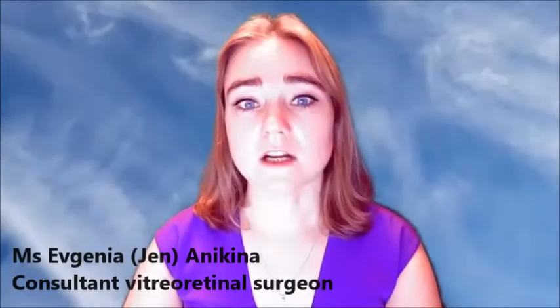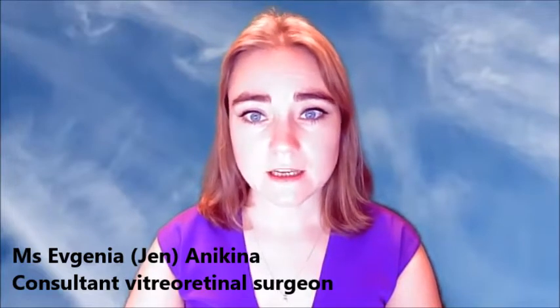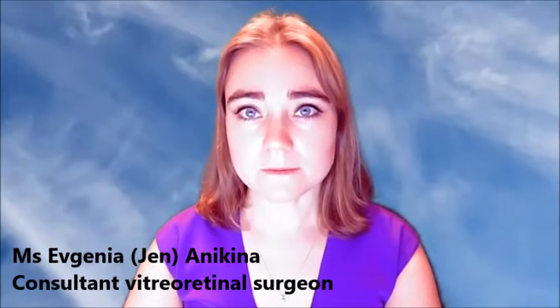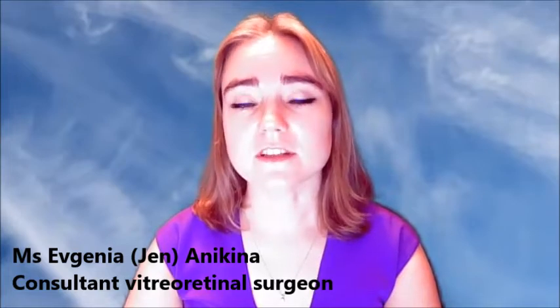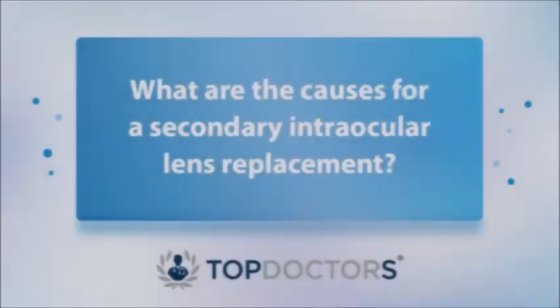If you have suffered a complication during cataract surgery and you have needed a period of healing before an intraocular lens can be placed, you will know that you require a secondary lens procedure. Without it, your vision will remain blurry and unfocused. The other common reason to require a secondary lens is if your natural lens or a previously placed implant has slipped or dislocated and your vision has reduced.